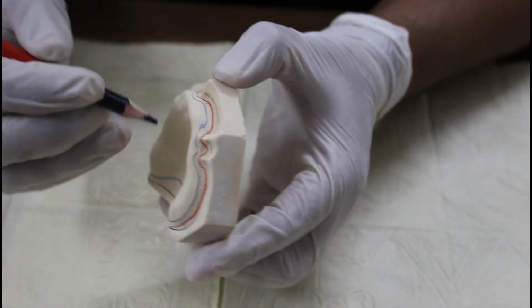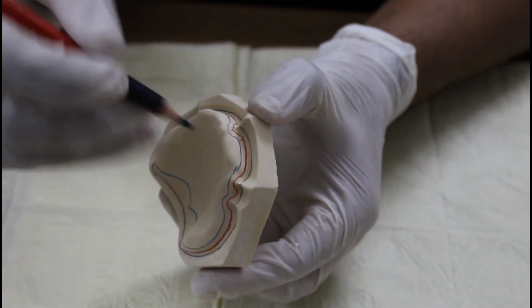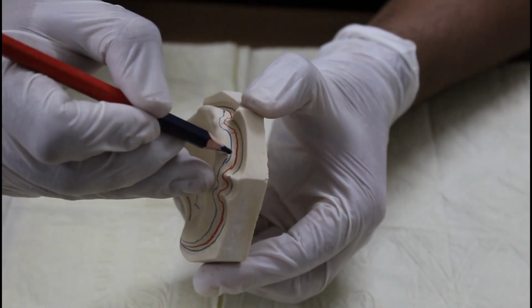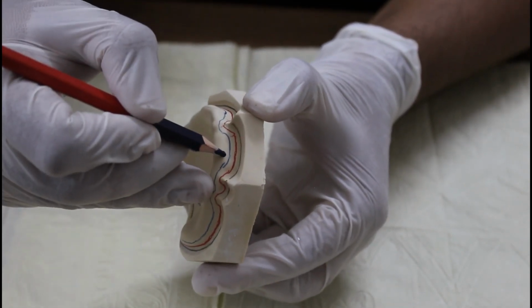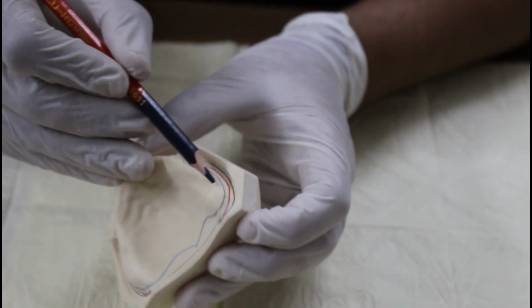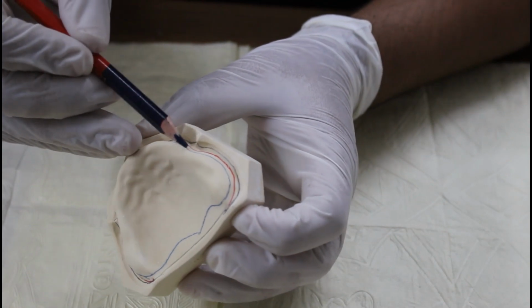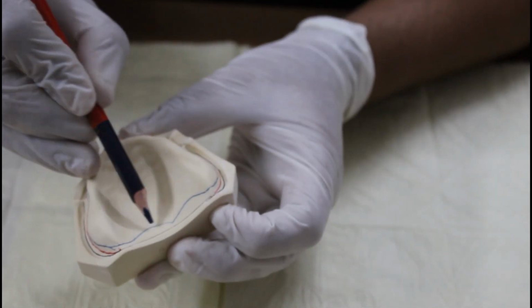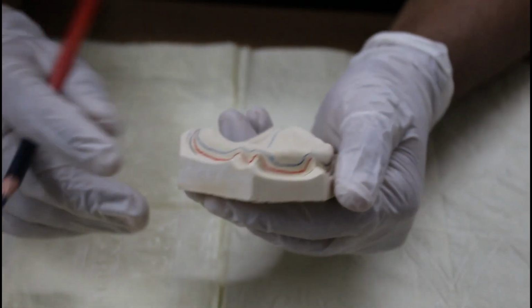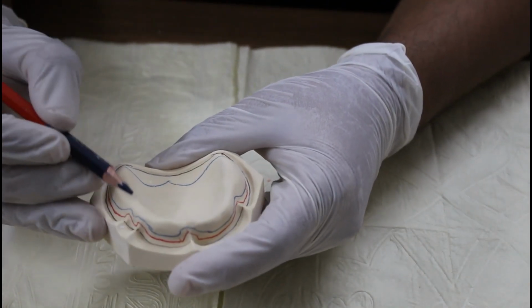So we have three lines. The one in the sulcus is the sulcus line. The one in red, 2 millimeters above it, is the tray line, and the third line, which is 2 millimeter above the second line, is called the wax spacer line. The second line will come and join the first line near the hamular notch. The third line will be 2 millimeter above, and in the posterior palatal seal area it will be bow shape. Once you draw this much, then you have to draw 4 boxes here in the canine and first molar region.